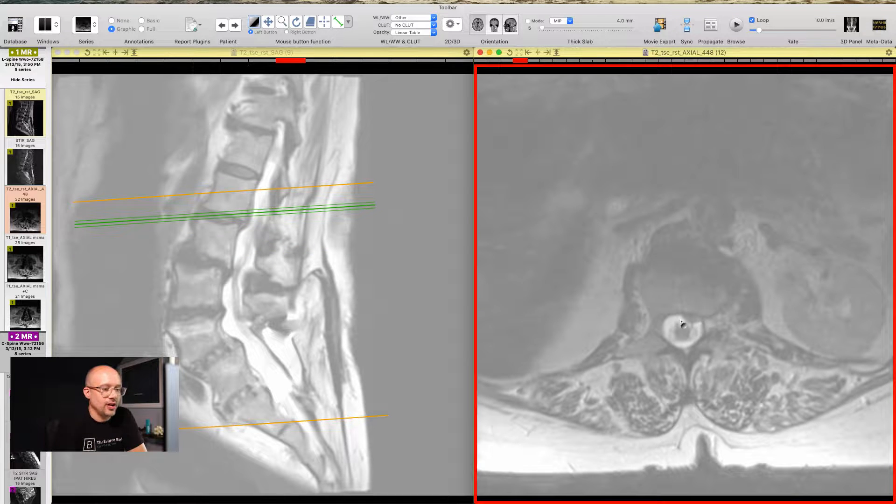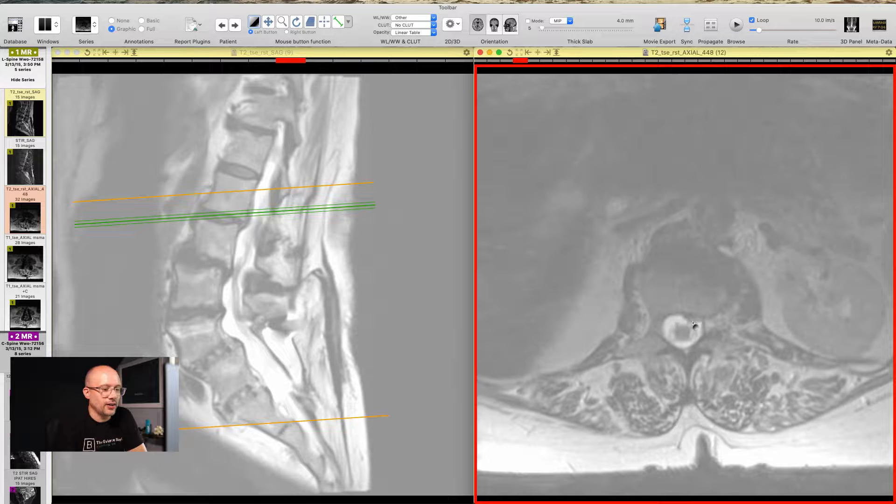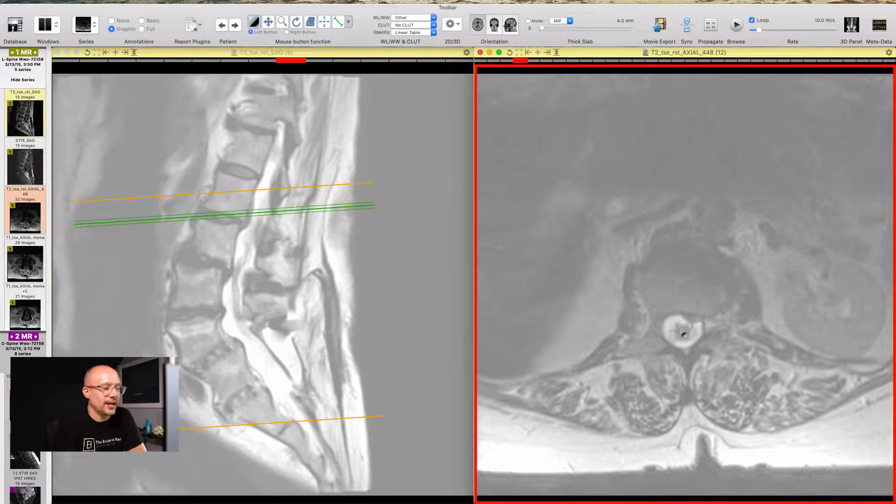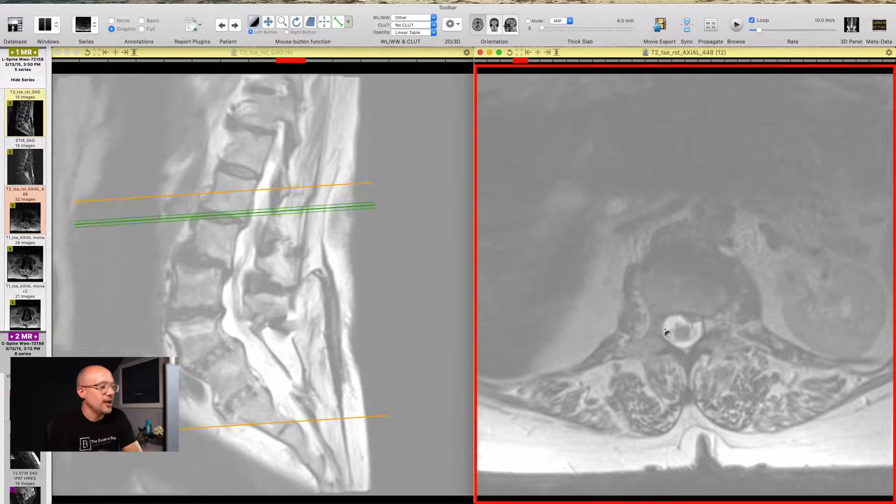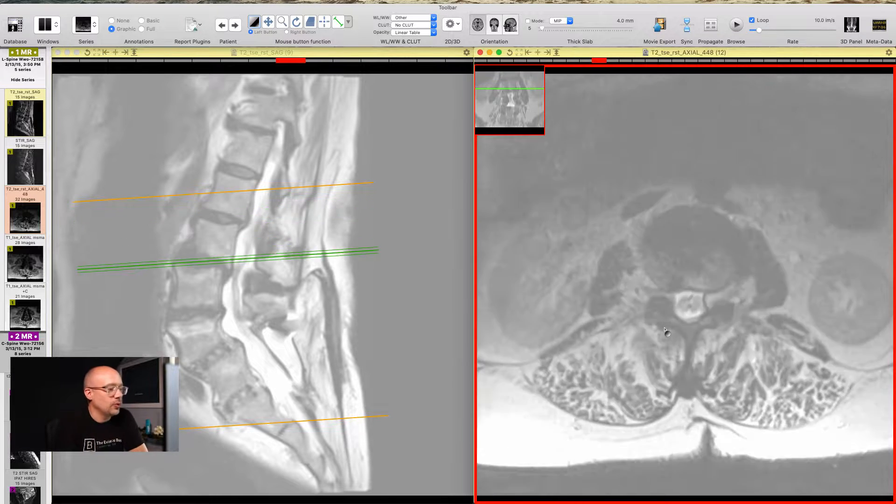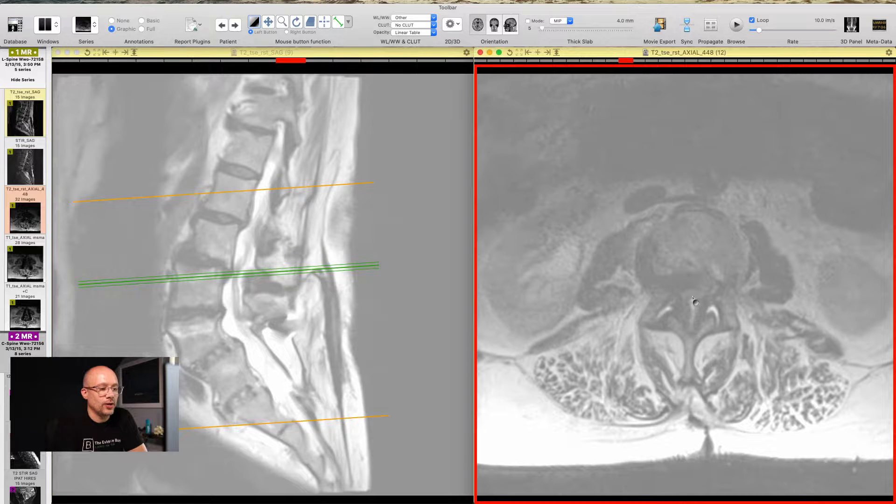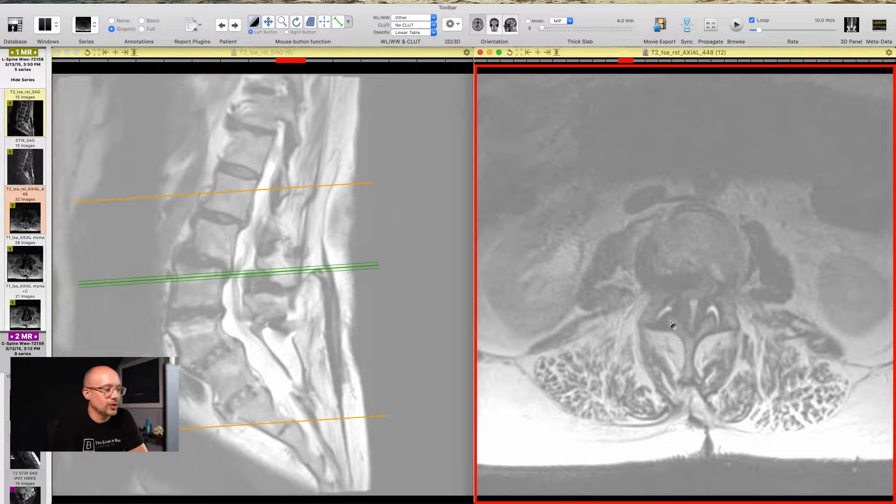Look at that, looking great. We see a little bit of a disc bulge right there, but look how wide open that spinal canal is compared to what we had down below and how compressed that was.